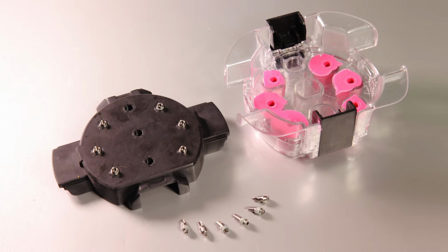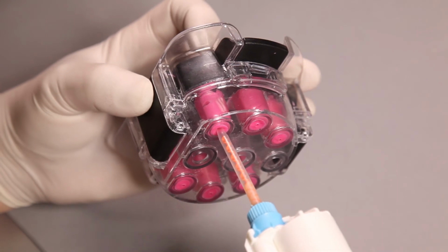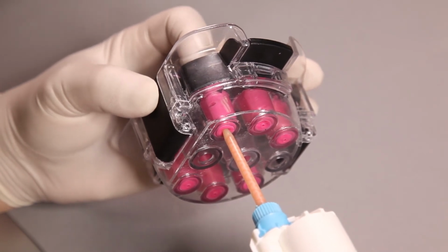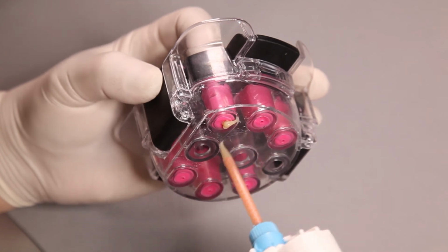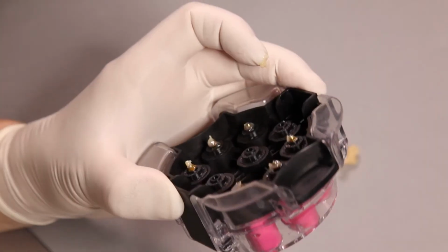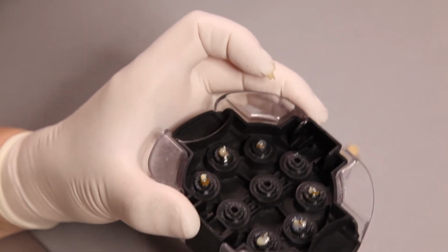Abutments are removed and the upper part of the box is again placed back on the lower part of the box. Through the funnels formed in the silicon casing in places of the former location of mounting screws, self-curing composite material is injected until it starts to come out through the outlet openings in spherical edges of analogs.